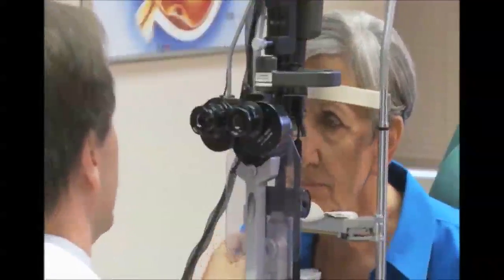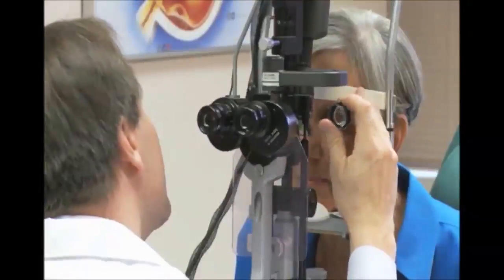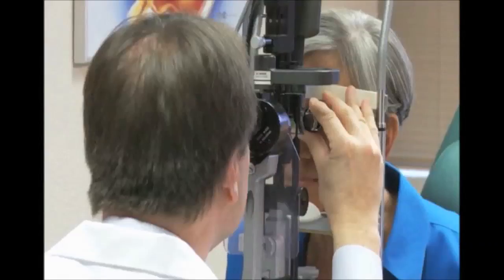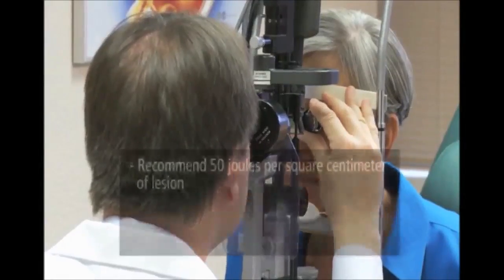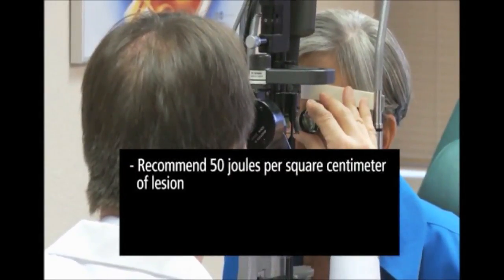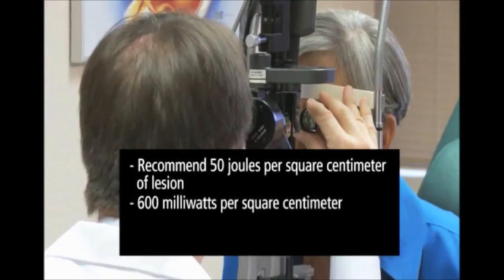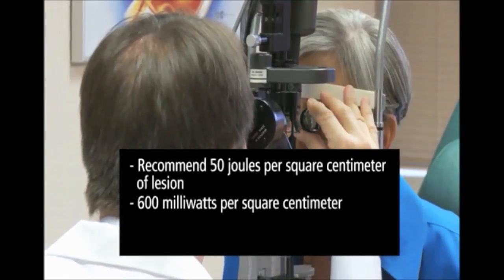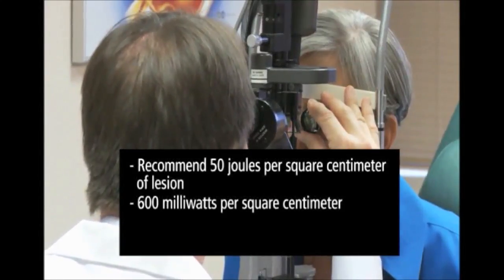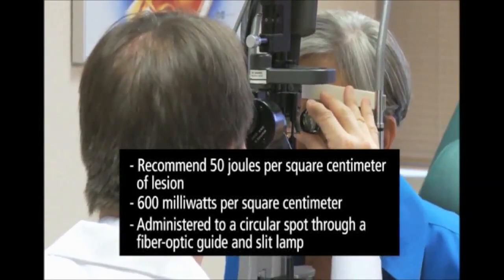Adjust the settings of the laser and place a focusing lens on the patient's eye. Photoactivation of Visudyne is controlled by the total light dose delivered. The recommended light dose is 50 joules per square centimeter of neovascular lesion. The dose is administered at an intensity of 600 mW per square centimeter delivered over 83 seconds. With the laser, deliver the light to the patient's affected retina as a single circular spot through a fiber optic guide and a slit lamp.